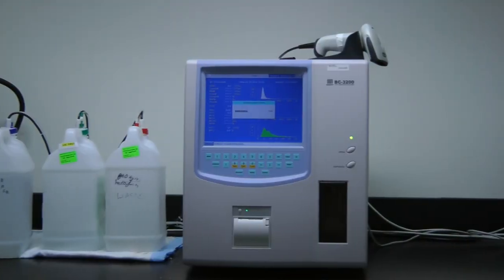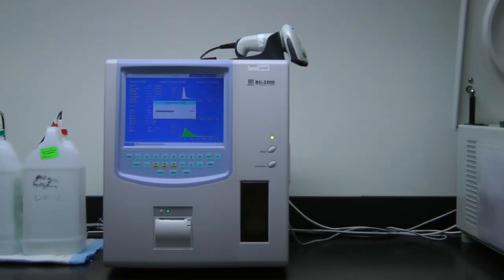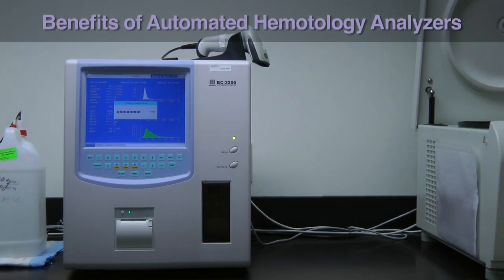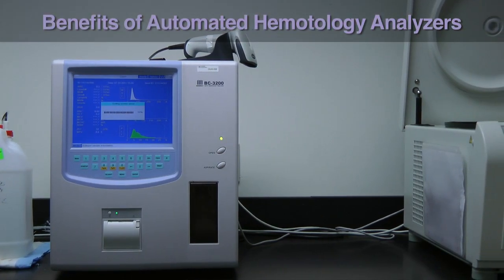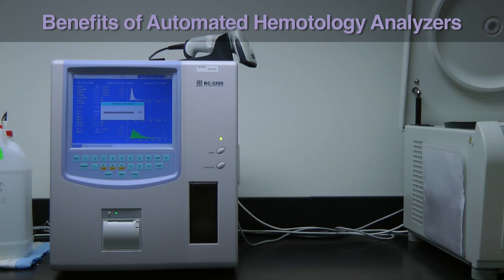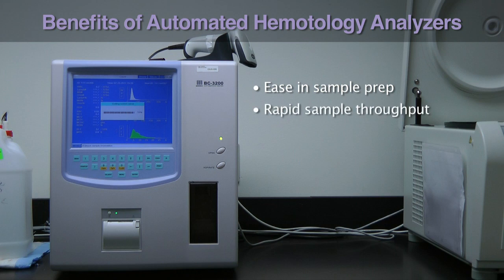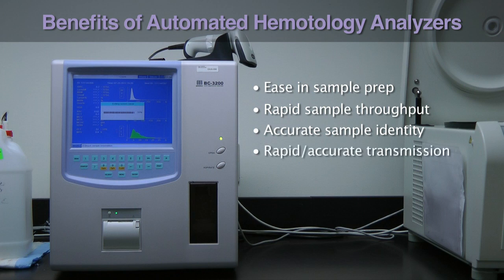PBMCs can be counted manually but this is labor-intensive. Use of automated hematology analyzers offer many advantages over manual cell counting methods: ease in sample preparation, rapid sample throughput up to hundreds per hour, accurate sample identity through the use of barcode technology, and rapid and accurate transmission of results into a laboratory information system.